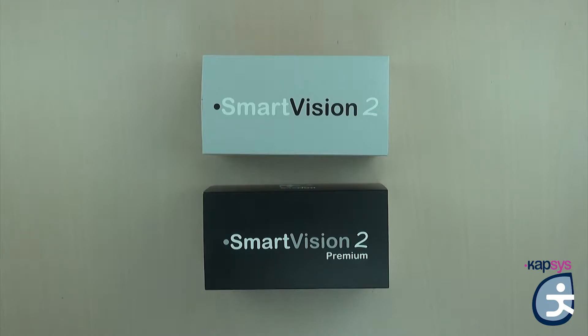Hello everyone and welcome to this first tutorial on Smart Vision 2. The aim of this video is to present this unique and exclusive device and provide you with the first steps on how to use it. We'll see together the content of the box, the product details, and start-up.